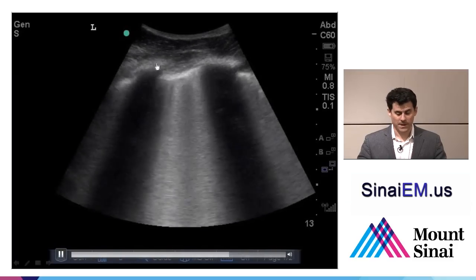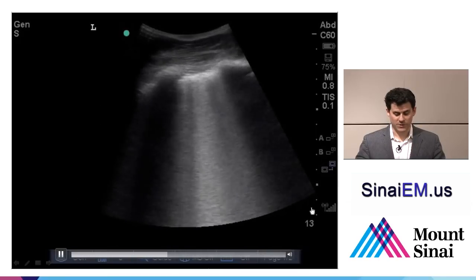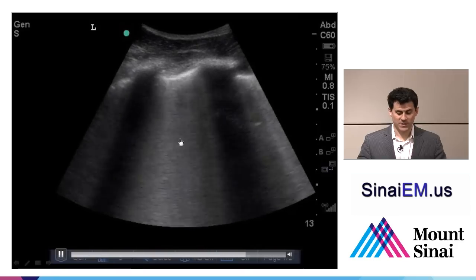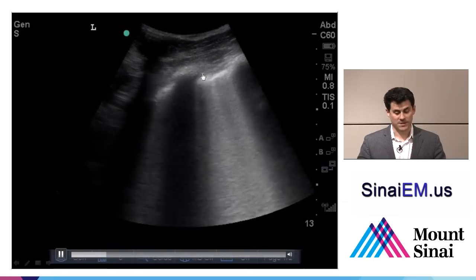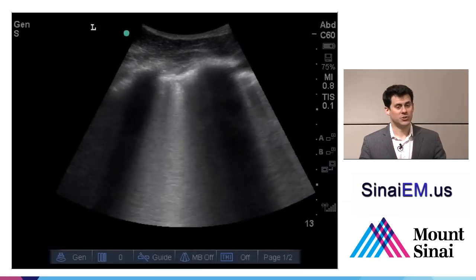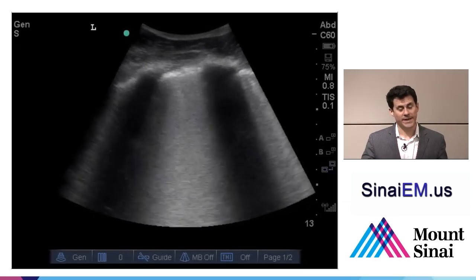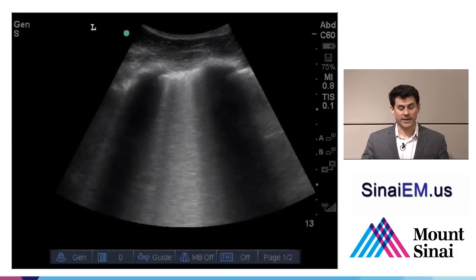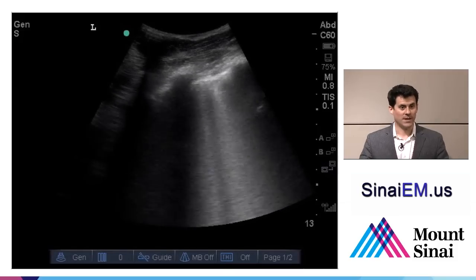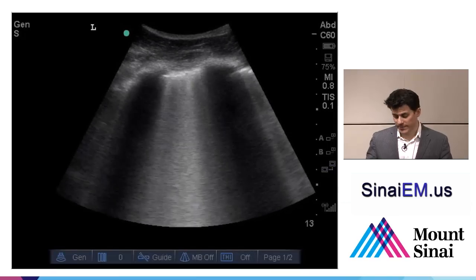So we see here rib, shadow, and another rib and a shadow. And then we see the pleura just beneath it horizontally. And originating from that horizontal pleura, the bright white echogenic pleura, we see all these bright white echogenic lines extending down way towards the edge of the screen as if we were looking at a shimmering curtain moving back and forth. So these are multiple B lines, and that is the pattern of pulmonary edema on ultrasound.